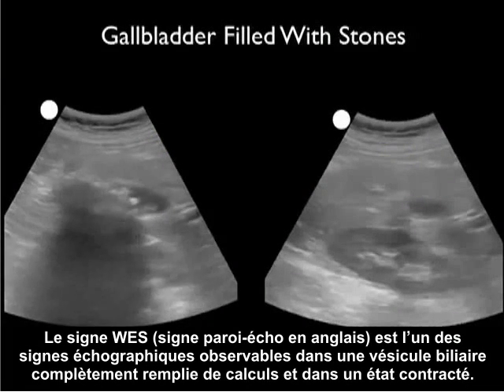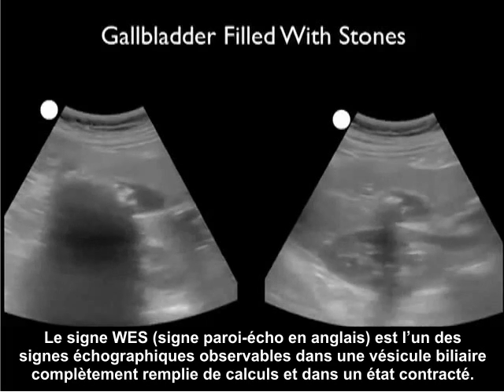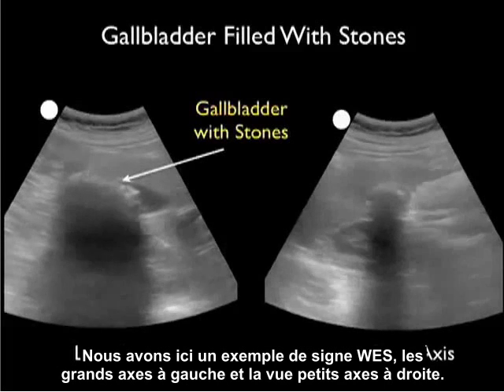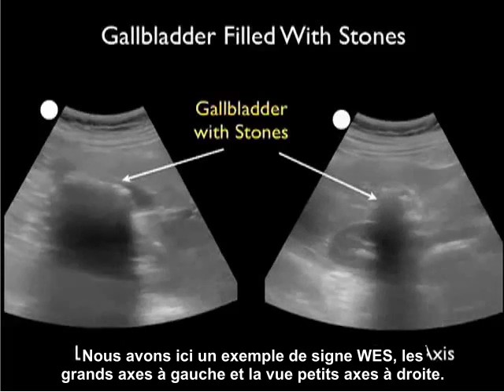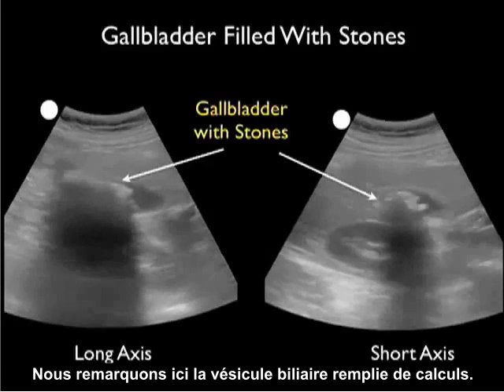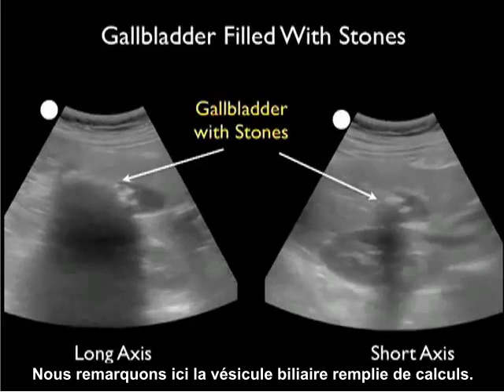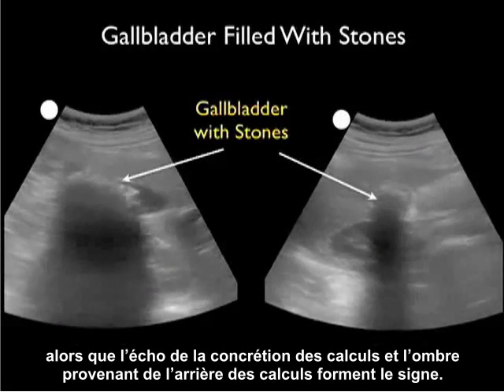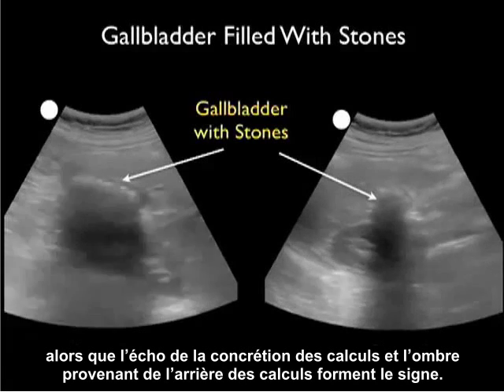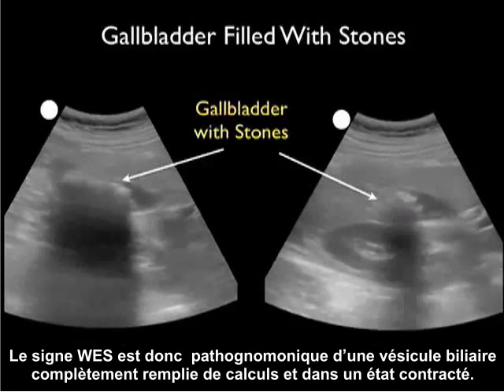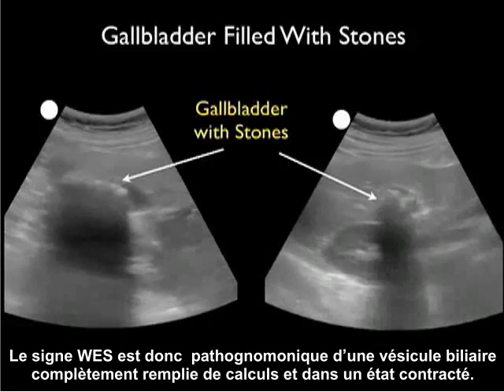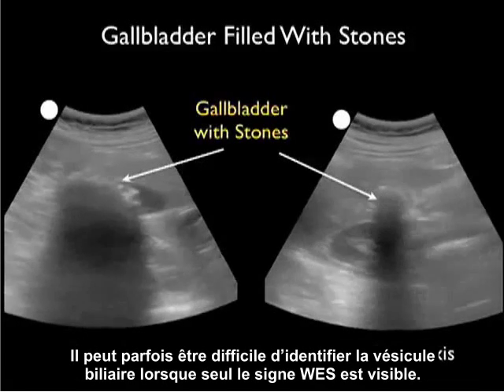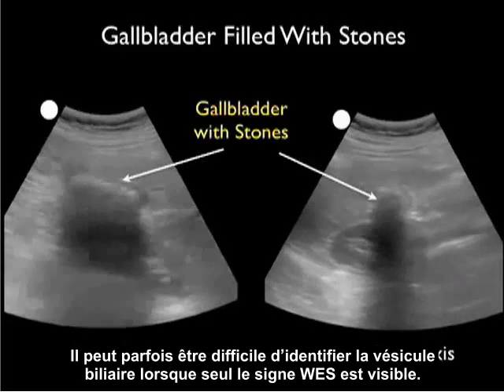A sonographic finding seen with a gallbladder completely filled with stones in a contracted state is the wall echo sign. Here we see an example of the wall echo sign in long axis on the left and short axis on the right. What we see is the gallbladder filled with stones — all we see is the anterior wall of the gallbladder, the echo from the concretion of stones, and the shadow off the back of the stones making the sign. The wall echo sign is pathognomonic for a gallbladder completely packed with stones in a contracted state, and it can be occasionally difficult to find the gallbladder when all you see is the wall echo sign.